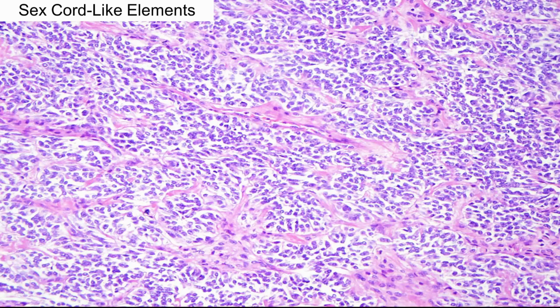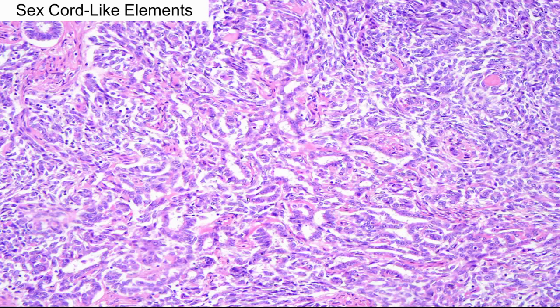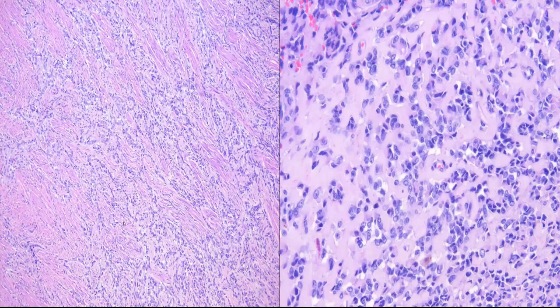So morphologically, these tumors are comprised of sex cord-like elements. You might see trabeculae or these nested kind of solid tubules that appear somewhat sertoliform. You can also see tubular growth as well as retiform growth. A corded pattern is typical and can ramify with the smooth muscle fibers of the myometrium. Some have this stromal hyalinization. And if you look, the cells are relatively non-atypical. They have variable amounts of cytoplasm, can either be scant or more abundant and eosinophilic. Mitoses are infrequent.